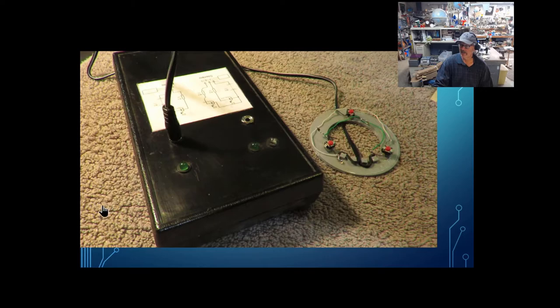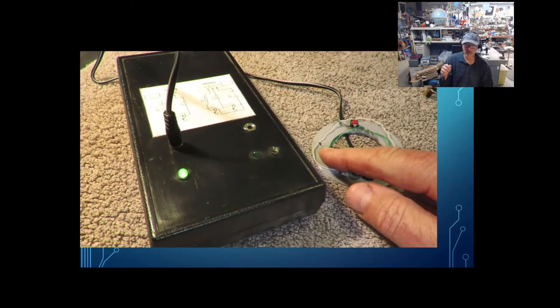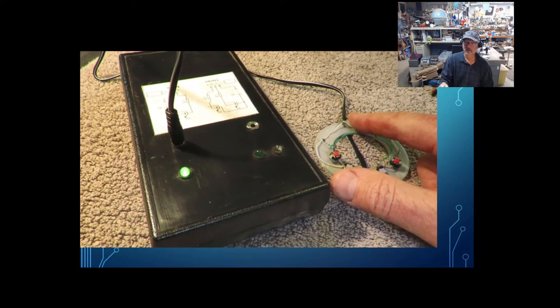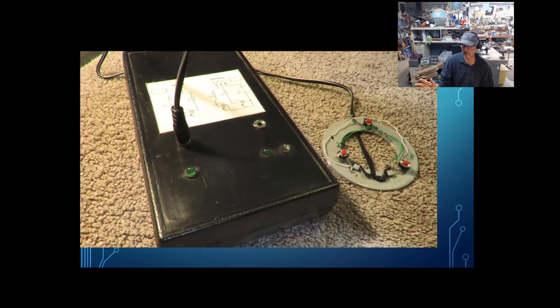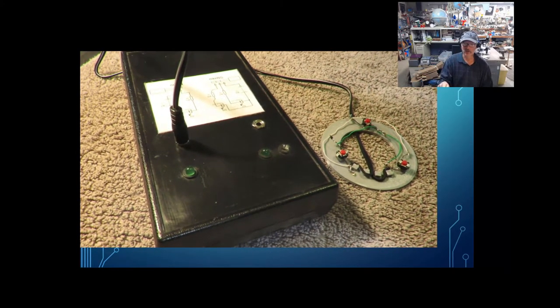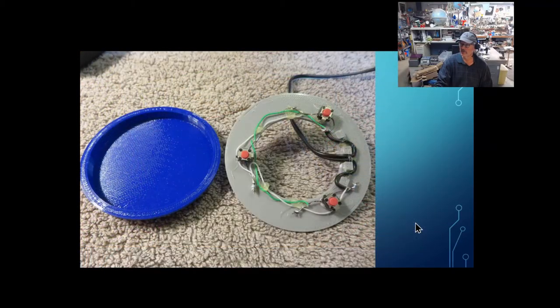Once that's done, I built this tester years ago, just to let me know when things are working. Now, if you have a toy you can plug it into, just plug it in and press all the buttons, and it should work on any button push. If you plug it in and it works all the time without pushing anything, you've made a mistake. Go back and look at your wiring. But once it's passed that test, then it's time to hot glue it, put it all together. And again, use a minimum of hot glue.